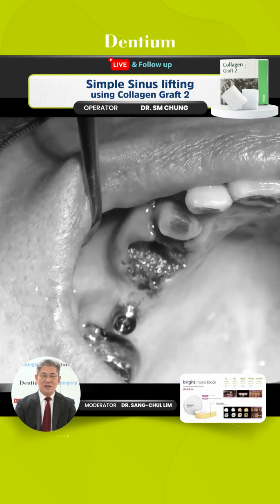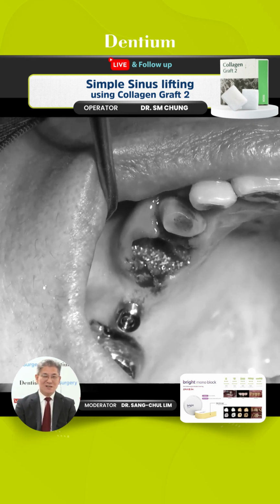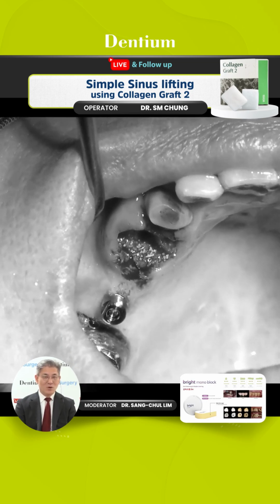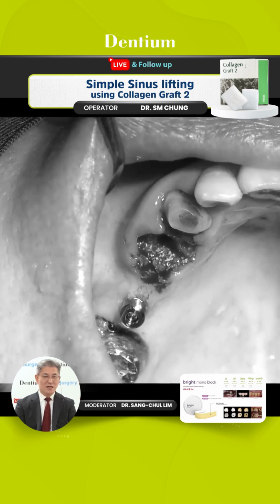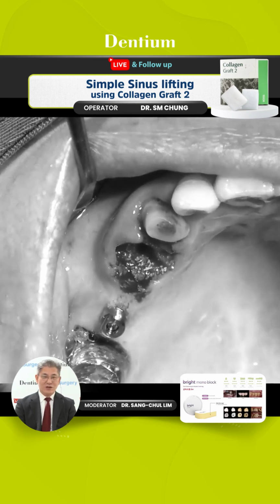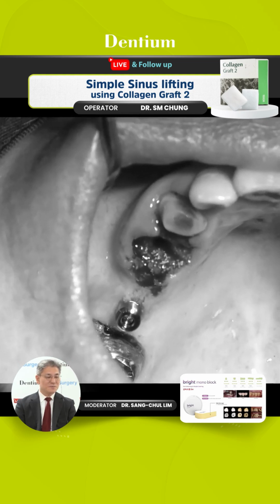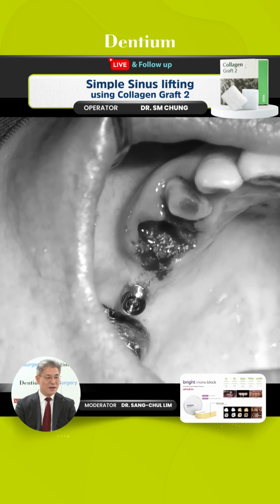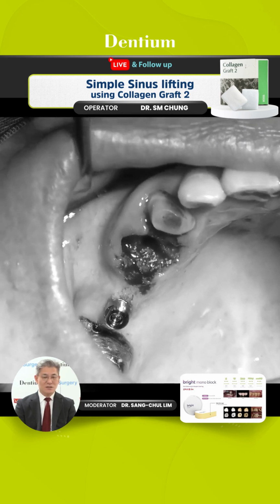However, the particle is a bit different. Osteon Xenocollagen is named to show us the key: the xenograft from the bovine bone, with collagen binders from the porcine side. However, Osteon 3 collagen means alloplastic bone, as you know, Osteon 3. Okay, now this applied collagenated bone was Osteon Xenocollagen.